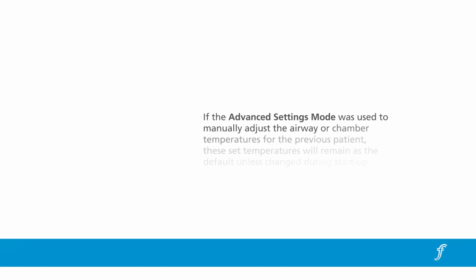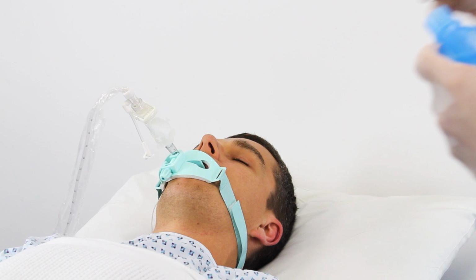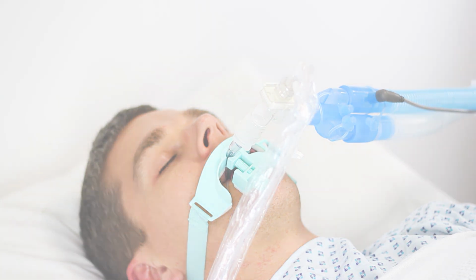If the advanced settings mode was used to manually adjust the airway or chamber temperatures for the previous patient, these set temperatures will remain as the default unless changed during startup. Refer to the instructions for use on how to manually alter or restore the default temperatures. Finally, connect the patient end of the breathing circuit to the patient airway or delivery device and begin ventilation.